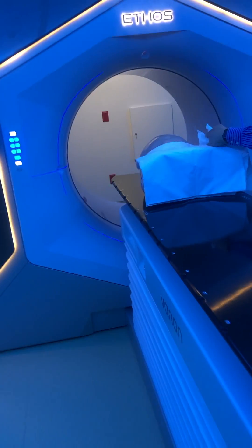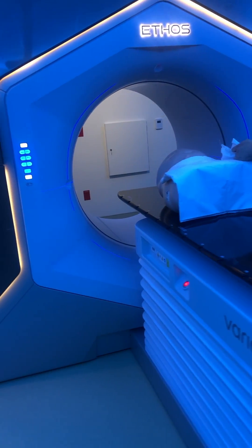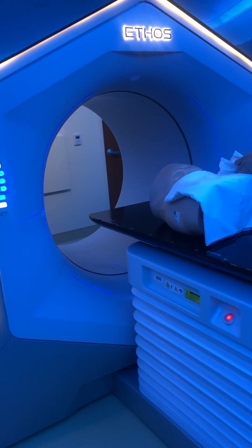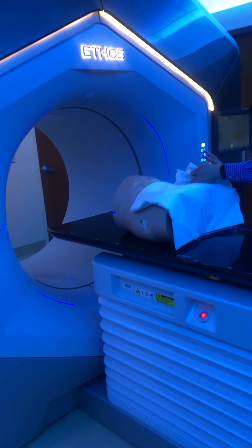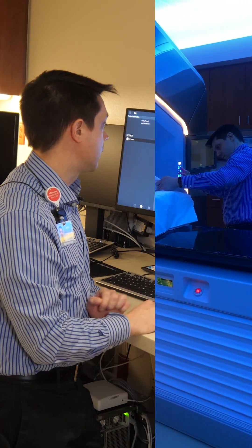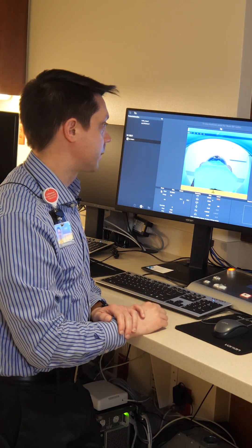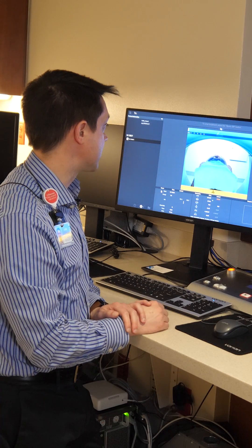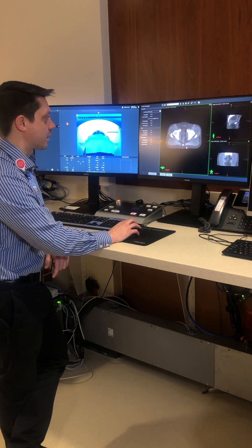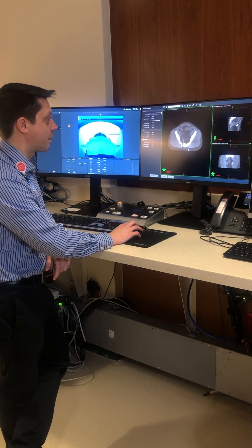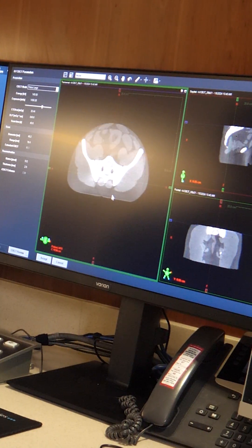With our artificial patient here, the first thing we would do is take a CT scan of the patient to determine their anatomy for today. That's what you can hear right now — that's what you can see the machine is doing. Now once we have a CT scan of the patient, we can review that patient's anatomy, how the CT scan looks.